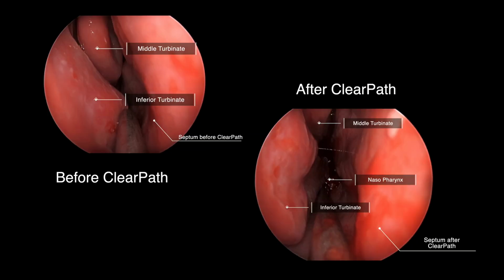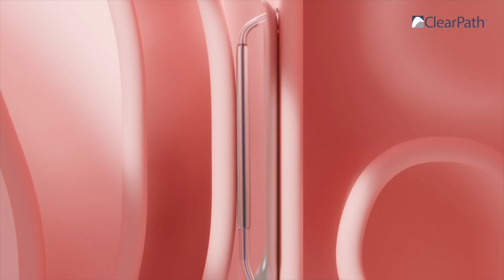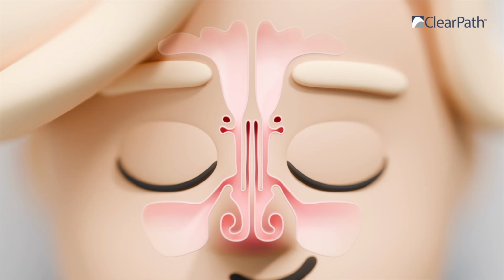As you can see in the side-by-side comparison, the ClearPath nasal balloon system allowed the surgeon to create sufficient spacing in the nasal passage. The ClearPath system offers surgeons control, efficiency, and lasting results for patients.